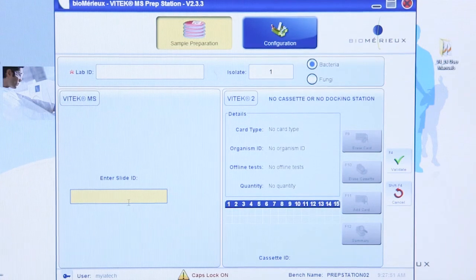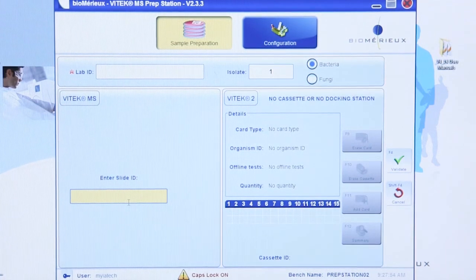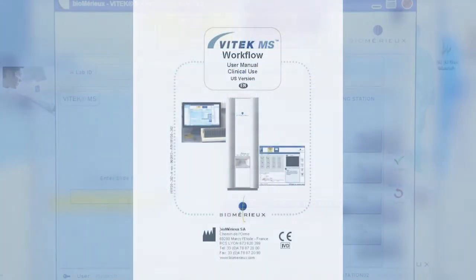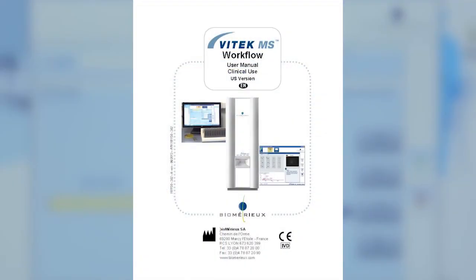Also note that any information entered incorrectly cannot be changed in the PrepStation software or in MYLA after the Send Slide button is clicked. For further information on sample preparation, refer to the Vitec MS Workflow User Manual Clinical Use U.S. Version.